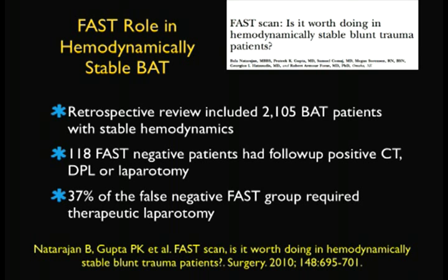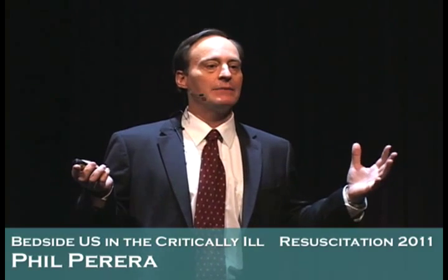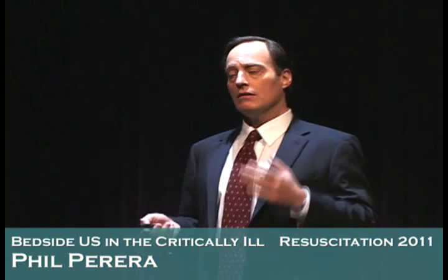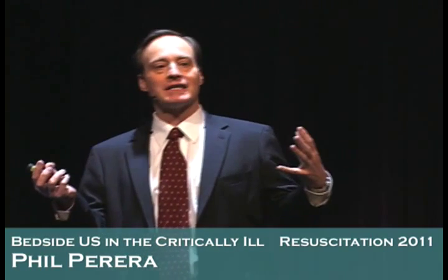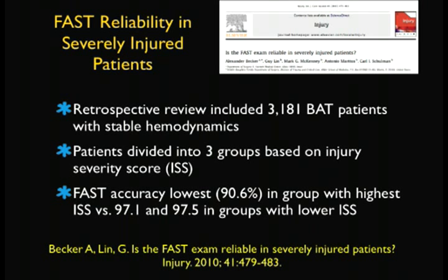Okay, so this was done by a bunch of surgeons who said, we better take a look at these numbers. Maybe should we be doing the FAST exam on hemodynamically stable patients? And that was actually the title of the article: Is it worth it? Well, okay, so that one casts some doubt on that. But we kind of know that the FAST exam works best in your unstable trauma patient. We all kind of know that that's really where we're going to be using it. And with the stable patient, we're probably going to be doing other imaging.